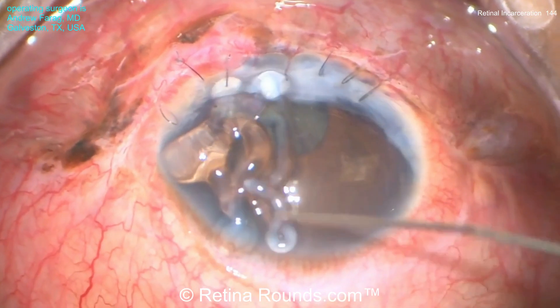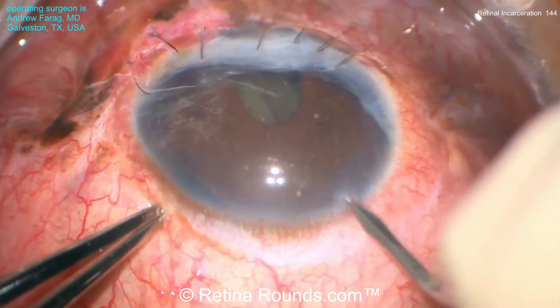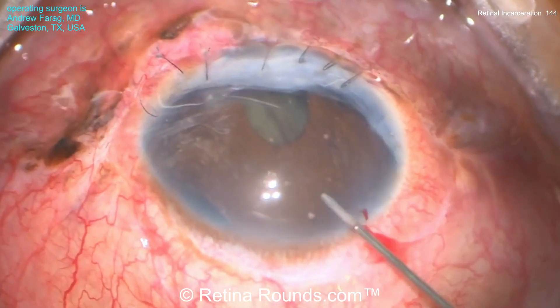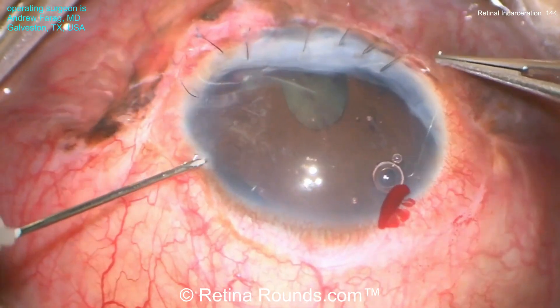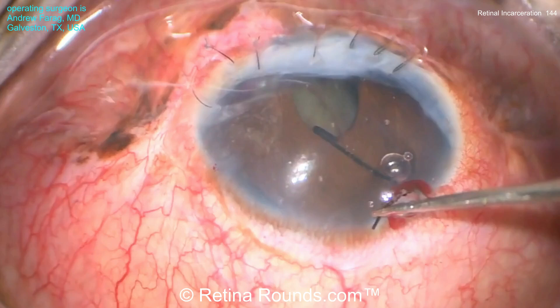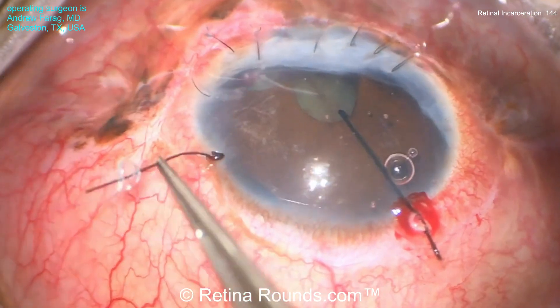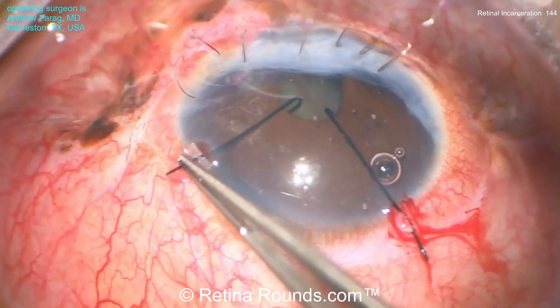The patient has significant corectopia. In order to get good visualization of the posterior segment and the subluxated lens, some iris retractors will need to be placed. Dr. Farag has created a small paracentesis and is filling the anterior chamber with viscoelastic. Using a 27-gauge needle, small paracentesis are made into the anterior chamber to accommodate the iris retractors, which are then used to expand the pupil.